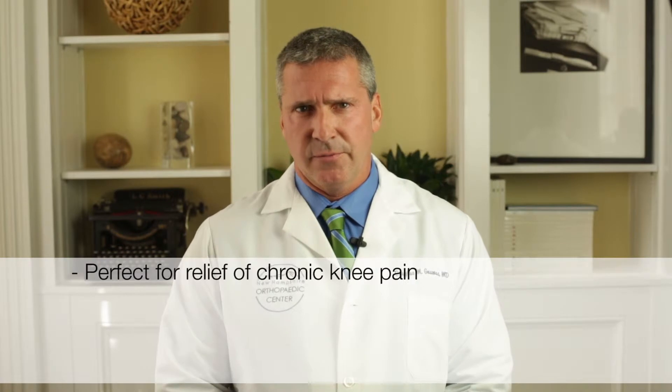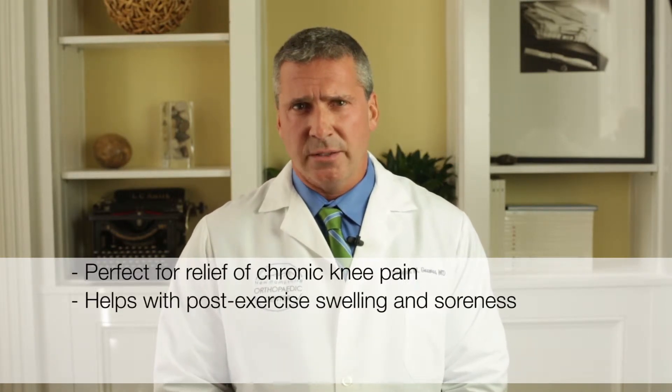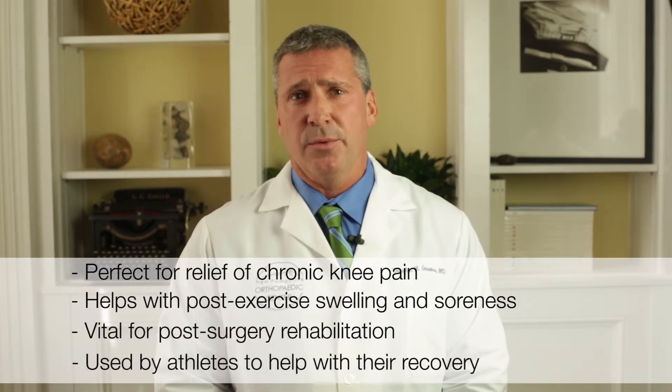Whether you're an athlete looking for a quick recovery or a post-operative knee surgery patient, you'll enjoy a more comfortable recovery with the Knee Cold Compressor Brace. It's perfect for the relief of chronic pain, helps with post-exercise swelling and soreness, and is a vital part of post-surgery rehabilitation and is used by athletes to help with recovery.